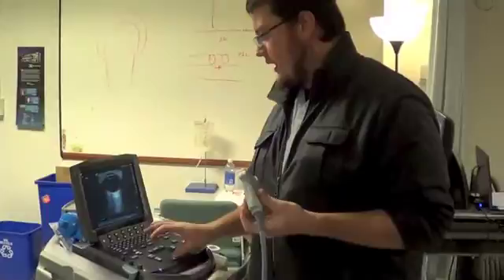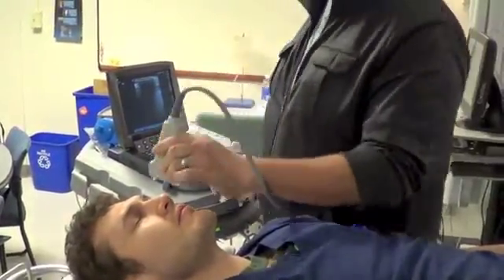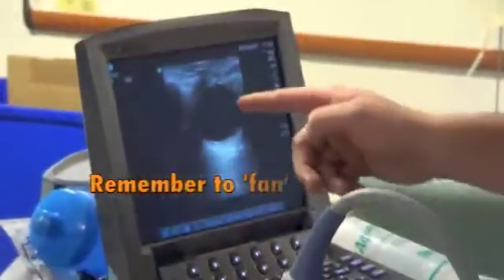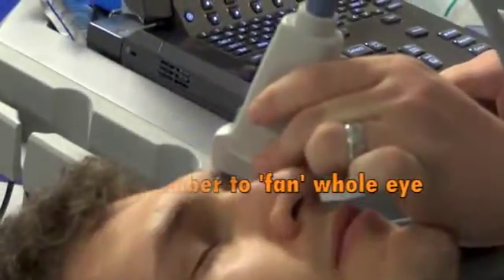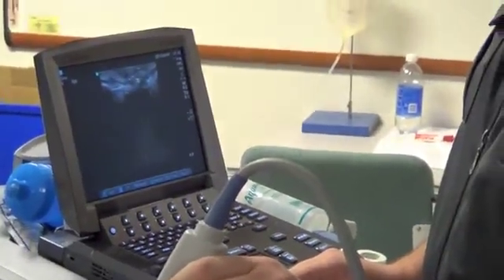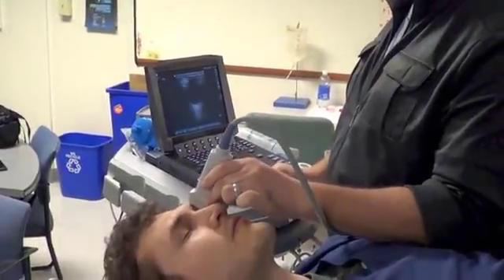There's another way to evaluate the eye. You're going to have the indicator towards the patient's top of the head, and you'll want to do the same thing — get your structures in view and fan left and right. This also helps you evaluate in another plane to look for any type of retinal detachment or any other abnormalities.